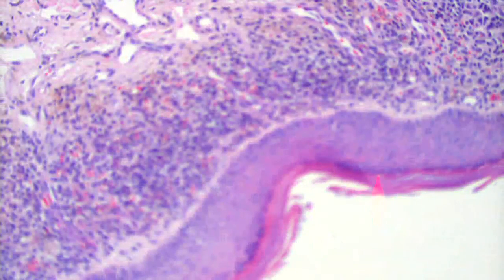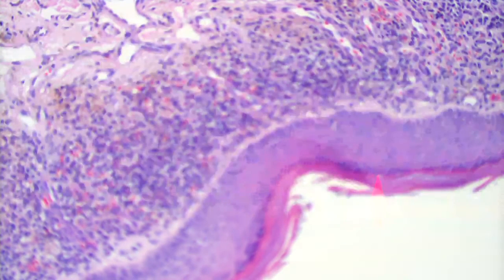Okay. You got that right? Yeah, and this guy was probably about 75 or something like that. So if he had this, he definitely gets an RPR, especially if he lives at the Villages or something like that, right? So anyway, that's what it looks like, lichen aureus. That's what it turned out to be this time.